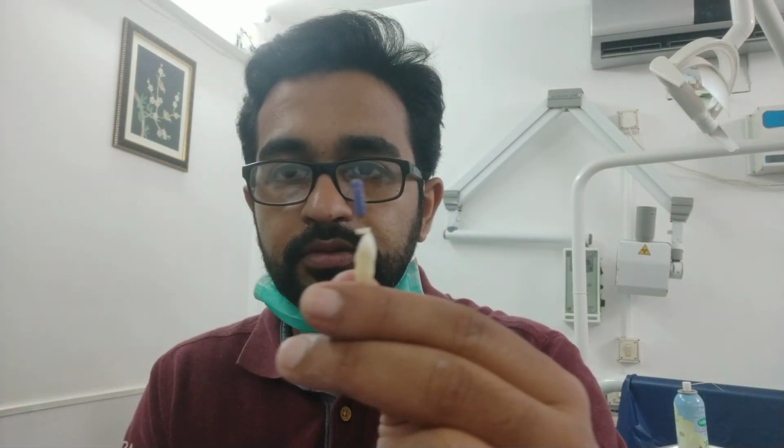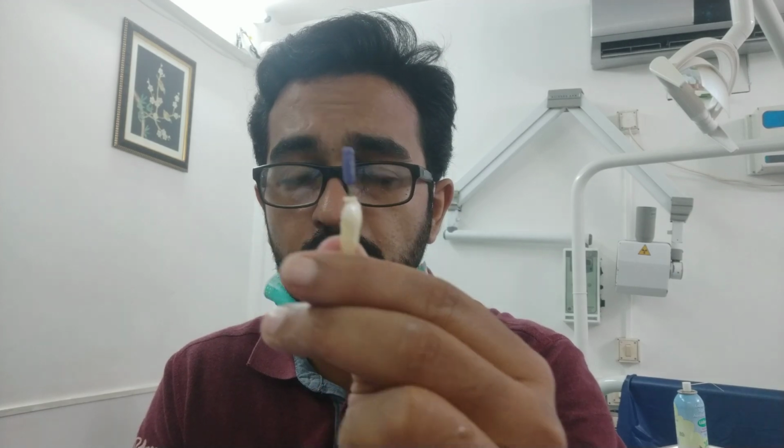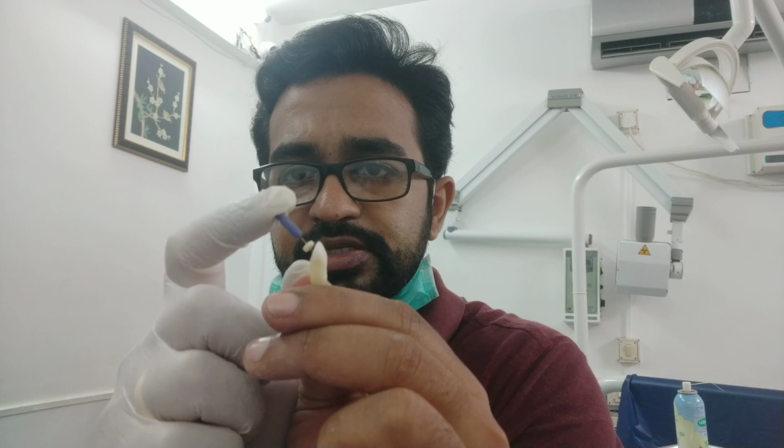So once the straight line access is achieved, see, I have got the access, a straight line access which is almost parallel to the tooth. It should not be like this, or should not be in any other direction. It should be totally straight line access. Okay, so I am holding the tooth like this. So this is the way the access opening of an anterior tooth is done. In my other videos I will show other teeth also.